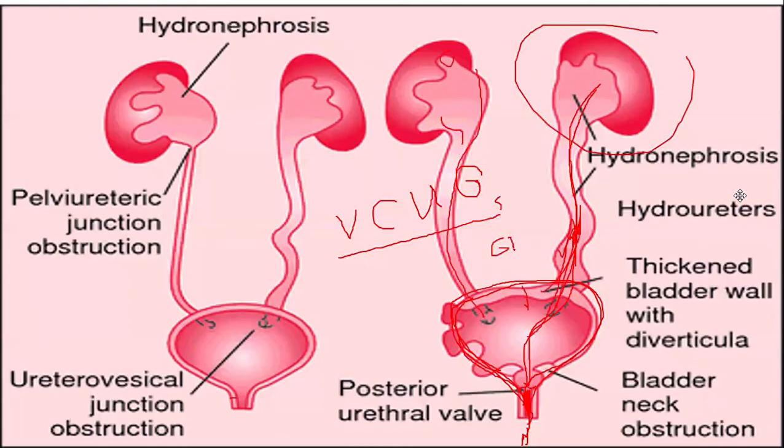Stage 3 is when it also reached the pelvocalyceal system, but there seems to be mild dilatation of the calyces. That is already stage 3. Stage 4 is further clubbing of the calyces. And then stage 5 is the worst, really big clubbing. So that is stage 5.